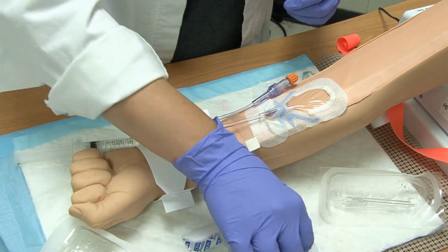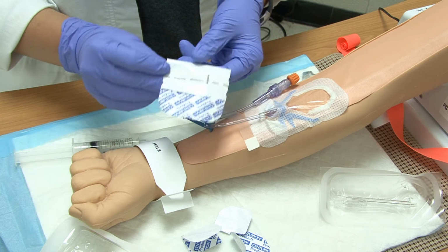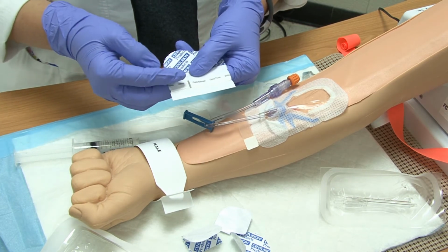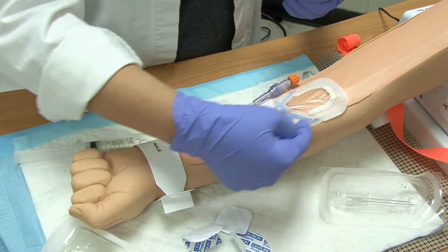At this point, you would now want to come back over to the securement device. Some of the packaging that comes with it has some stickers on here, and you'd want to put the date, time, the initials, and the gauge of the IV on here, and you'd want to peel this off after you've written it, and put it off to the side.